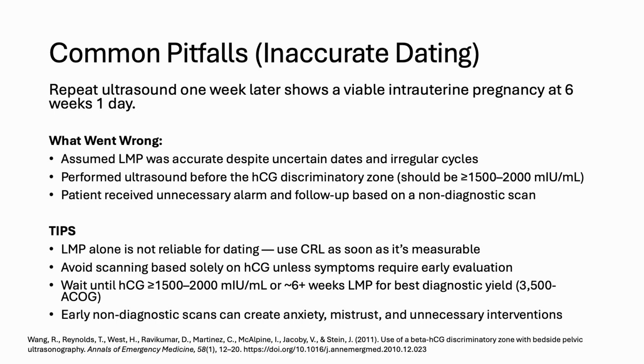And in this patient, she wasn't bleeding. She didn't have any pain. So we can have more observation and follow up with this patient. The patient received unnecessary alarm and follow up based on a non-diagnostic ultrasound.